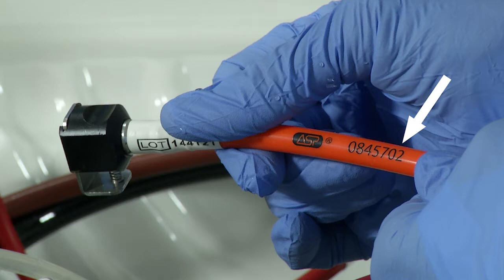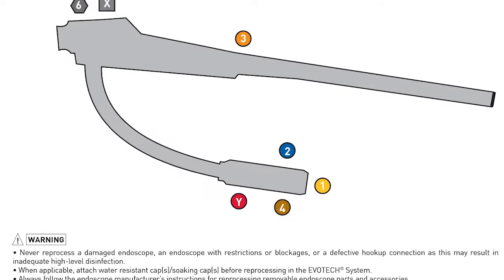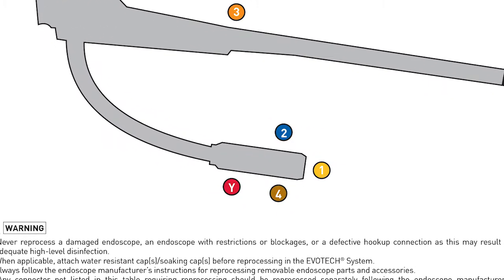Make sure you confirm that the part numbers printed on the connectors are correct for the scopes you are processing. The diagram also demonstrates where to place your connector both on the basin and the scope.